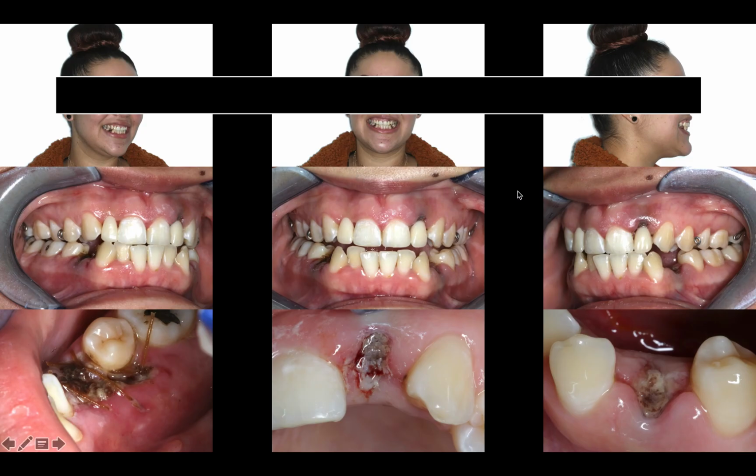And then here, this is that same appointment right after I finished. We took more pictures. Here, she's currently wearing the stay plate that they delivered. I think it looks great. I think the color match was really good. The shape is really nice.